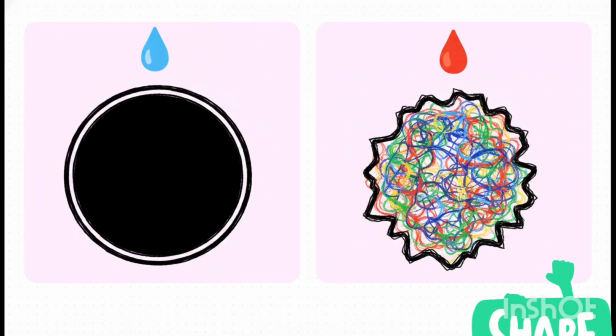And this brilliantly illustrates your absolute key differentiator. When you switch on color Doppler, a tumor will often light up with internal blood flow. Cysts are just fluid, so they stay dark, but tumors have a real blood supply.